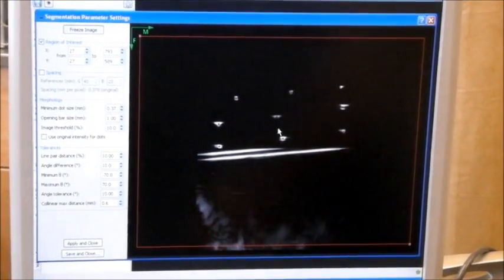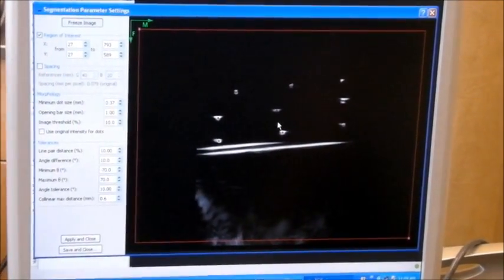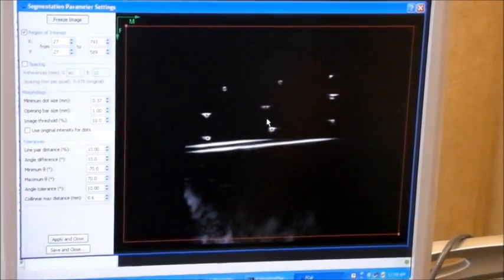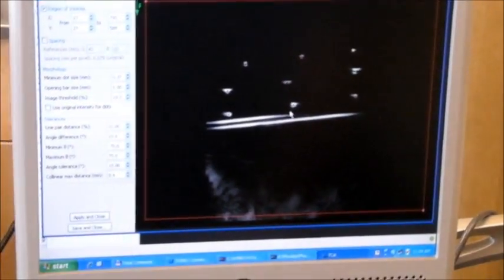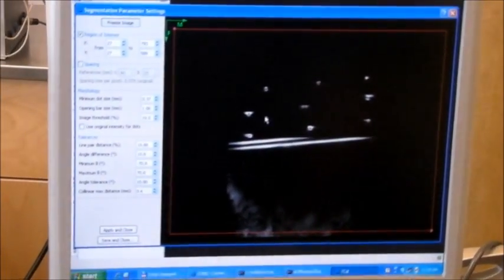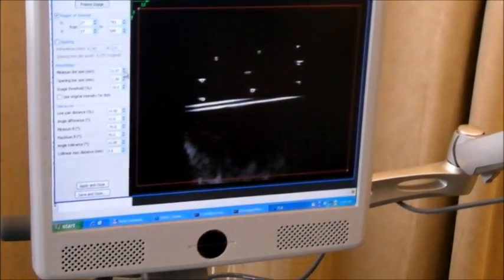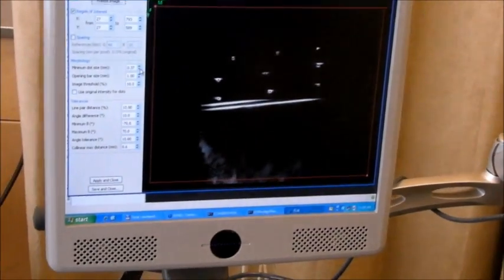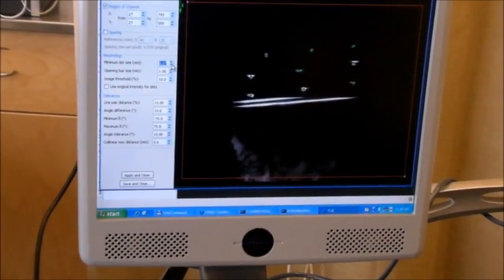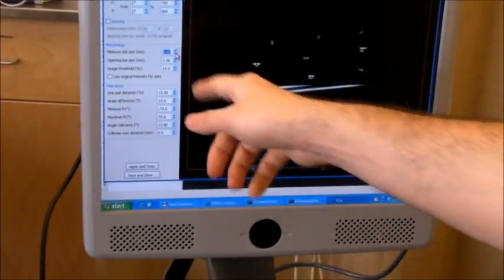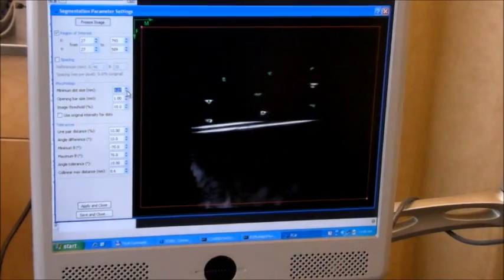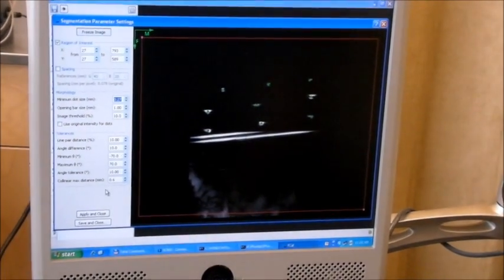If you see red dots, it means that the segmentation algorithm could find the candidates, but not the pattern. So, it's better if I decrease this minimum dot size, and you can see that it's already segmented.